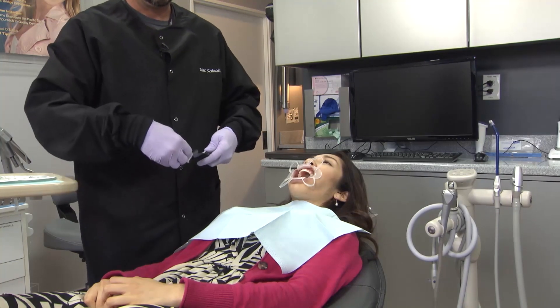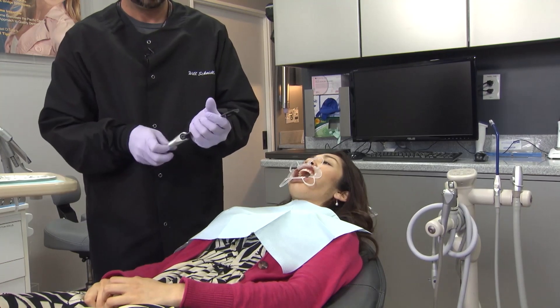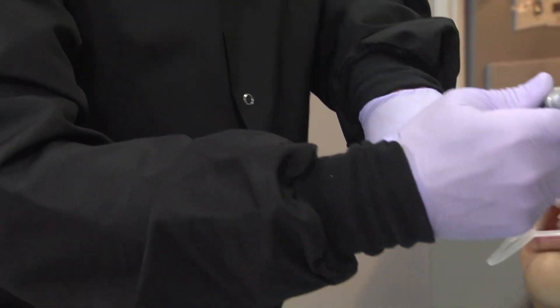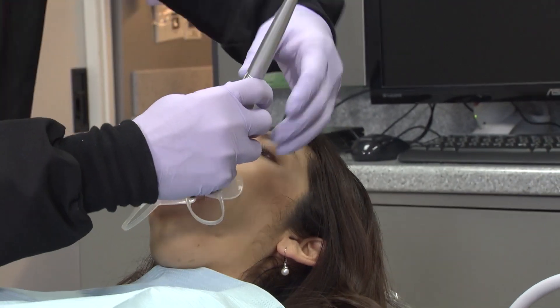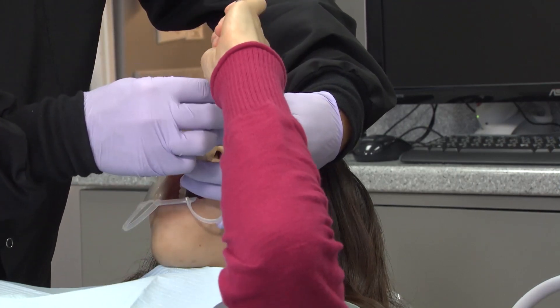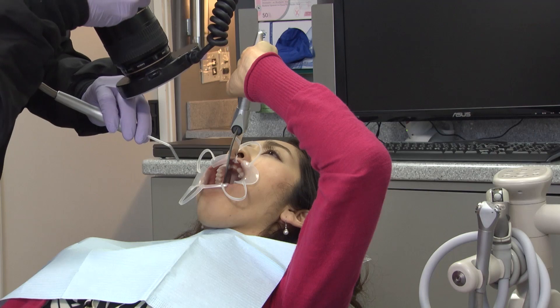While setting up for a lingual photo of tooth number 30, I make sure to turn my mirror around so that the small end of the mirror can reach into the mouth and not cause any discomfort while the patient is opened. Give your patient or assistant holding the mirror handle very specific step-by-step instructions on the angulation, arm position, and retraction that you need for each photo. A nice air stream is effective in defogging the mirror as well as removing any saliva bubbles from the subject area.